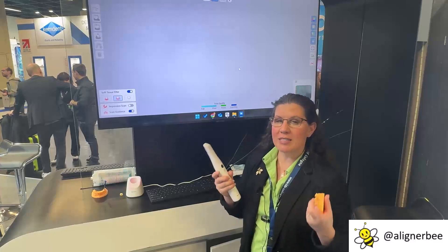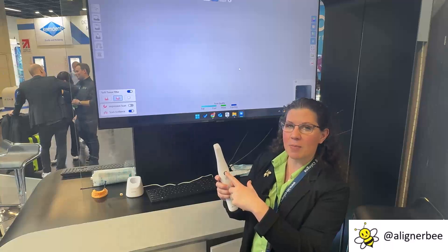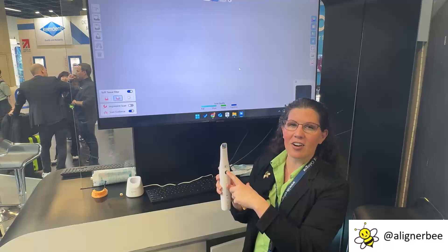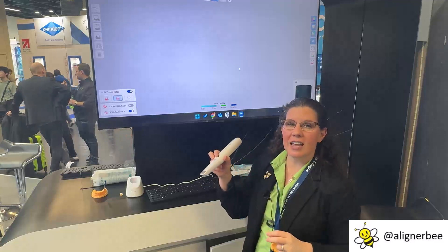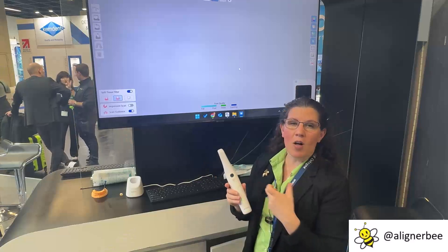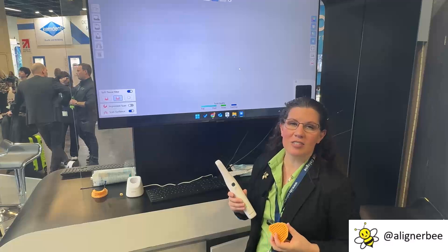I was excited to see with the new Allied Star they have an activation button both on the front and on the back side of the scanner, so that you can access it whether you're scanning for the mandible or if you flip it over to scan for the maxilla. The lower button will also let you switch between the arches in the software as you're scanning.